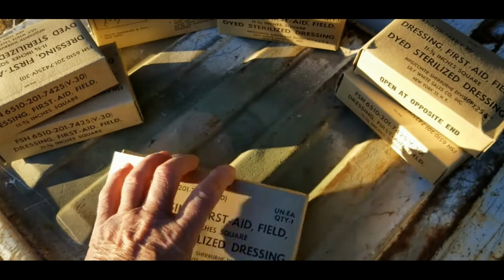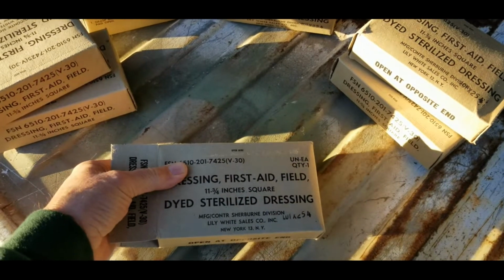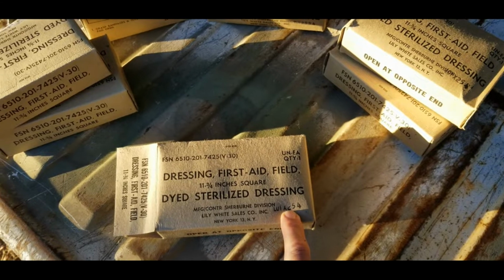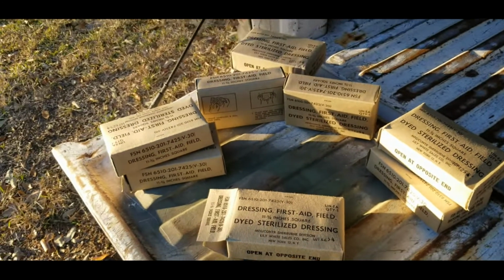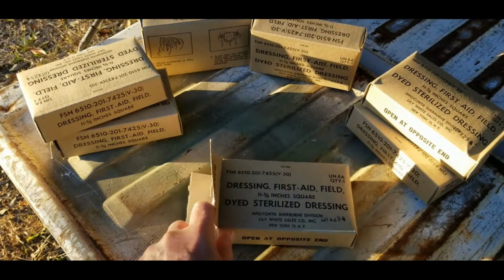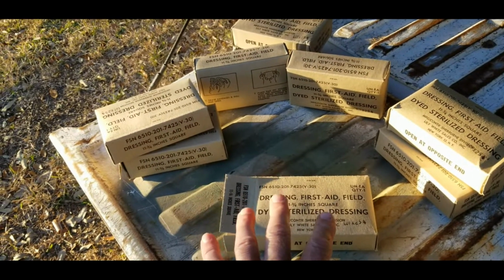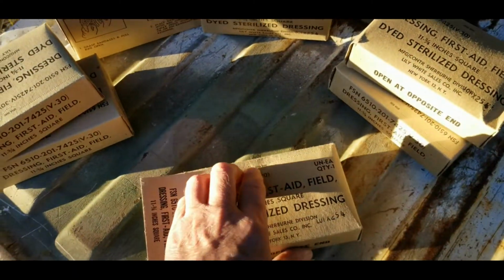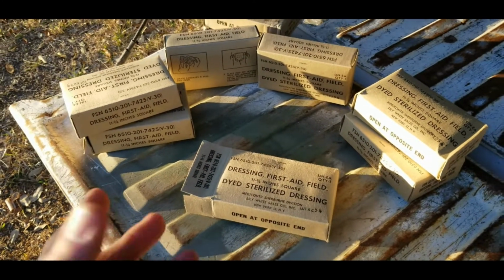I don't see any dates on them, so I don't know how old they are, but they're in fine condition. I can't tell from that lot number exactly what that means, but somebody else may be able to. This one's open, but I opened it, just kind of peeking in. And what I'm going to do is go ahead and sacrifice myself and open one of them, which I see here now that there is a press tab to open it from the top. I don't know why that's any better than opening from the side, but it is.